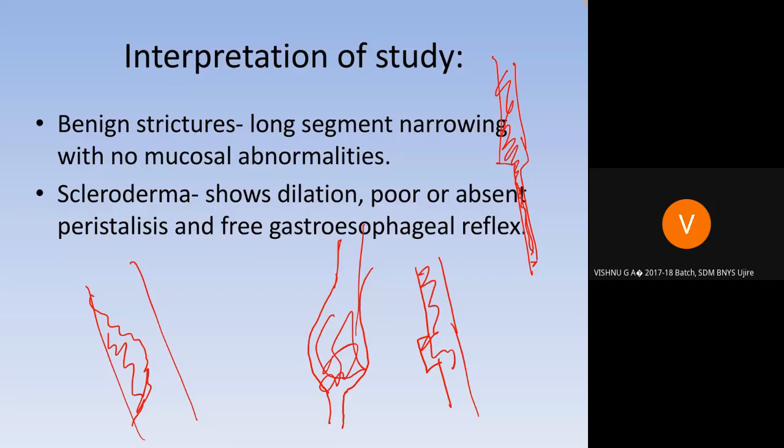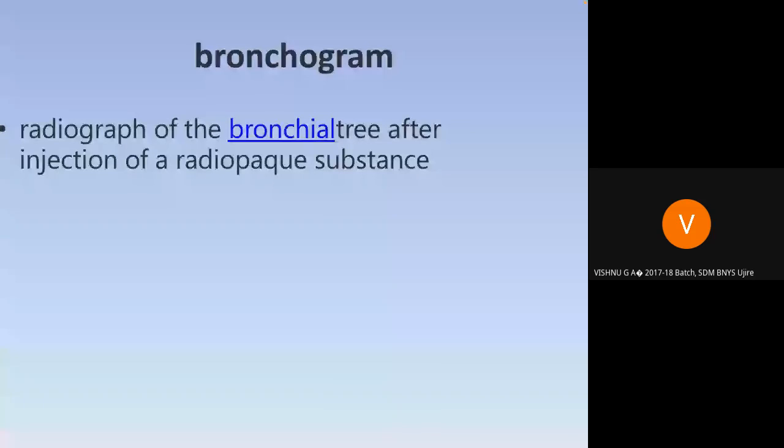But if you are suspecting, suppose your patient is a known smoker, he always complains of gastritis, and you want to rule out a GERD, you will know that there is lower dilatation of the esophagus because of the acid that is coming out from the stomach. So you can correlate with your study. Next, we'll see the images later as they come along.